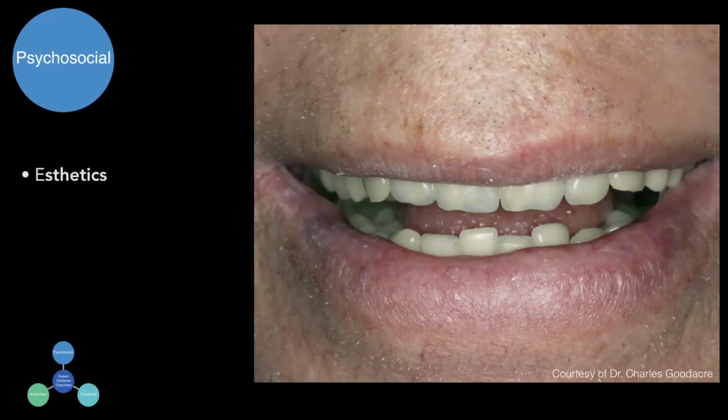And you can play with the teeth, the position of them, and we can make them a little unbalanced and maybe give it a more natural look. And patients will be happy with dentures because it brings some confidence for them and it affects their quality of life. It's been mentioned in different literature.